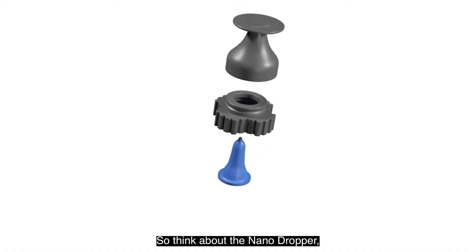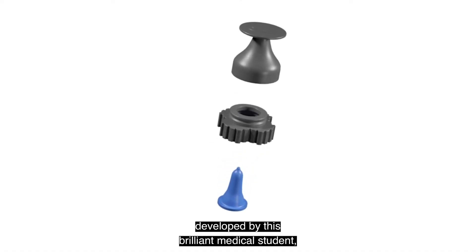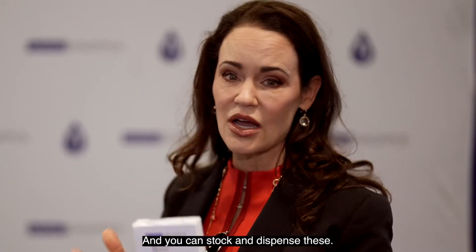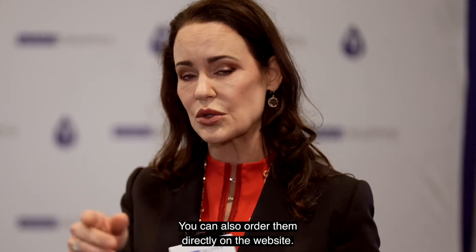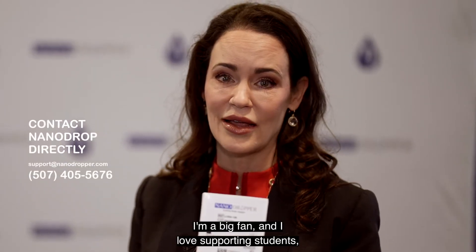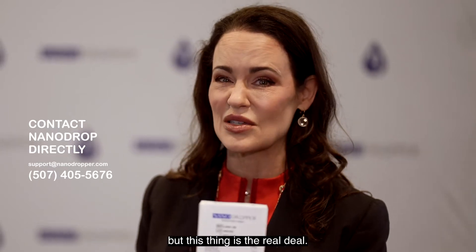So think about the Nano Dropper developed by this brilliant medical student, Alyssa Song. She's amazing, and you can stock and dispense these. They're a very reasonable price point. You can also order them directly on the website. I'm a big fan and I love supporting students, but this thing's the real deal.